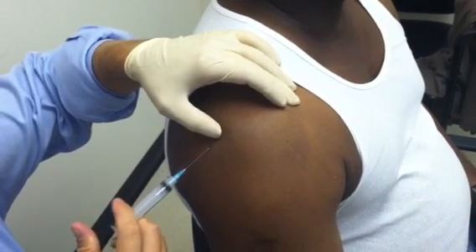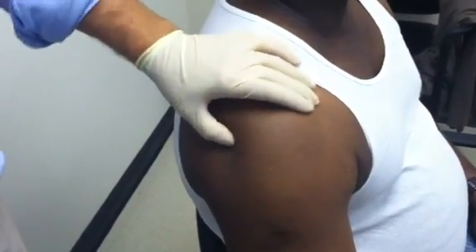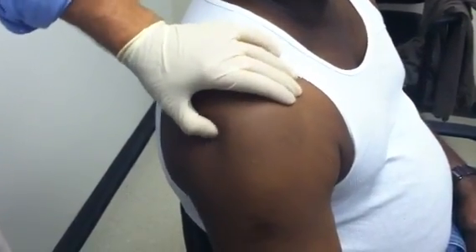All right, that's it. We'll just cover that with a band-aid and let him sit in here for about five or ten minutes. We'll come back in and examine him to see if his pain goes away.